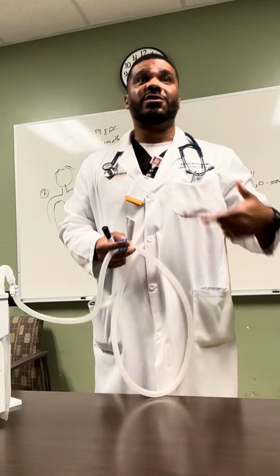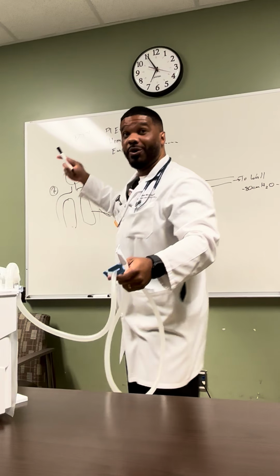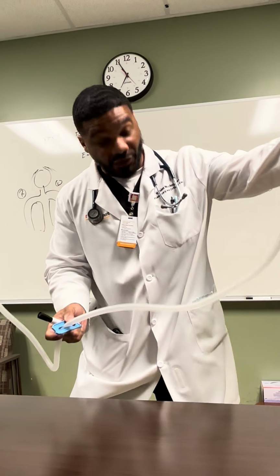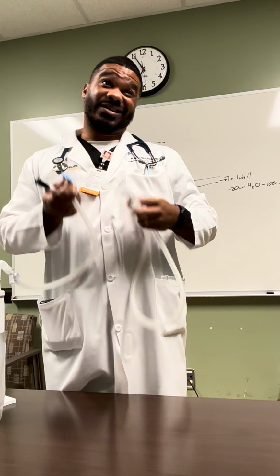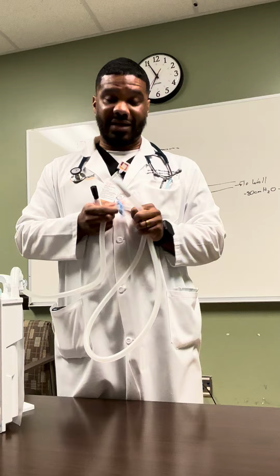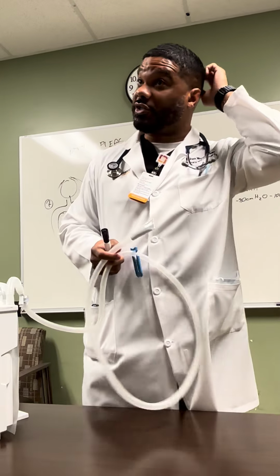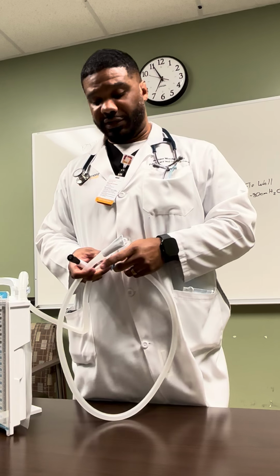But one of the first things to do when a patient is in respiratory distress and being treated for a pneumothorax or something else is, when you're assessing down the line for the chest tube, one of the common things you'll see is that the chest tube is clamped, right? And it's not going too well for the patient. So in those situations, unclamp, and then at that point you probably want to turn the patient back to wall suction and call the provider. You can always do all of those steps before calling the provider. Absolutely. It's not going to hurt the patient. So unclamp the patient.